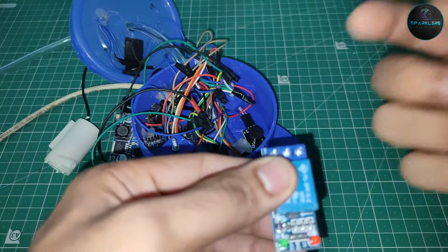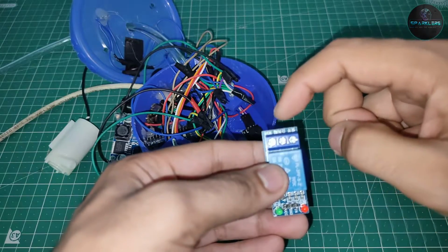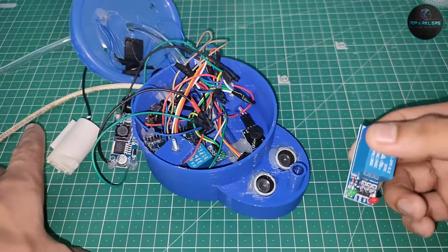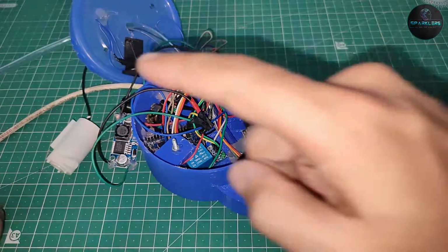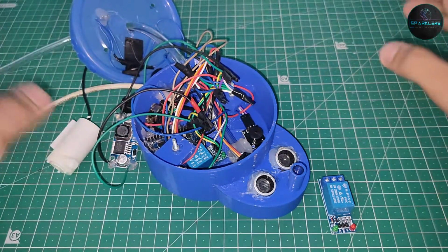rightmost pin. So whenever we turn this relay on, the relay will connect these two pins, the right one and the middle one, and our pump will get power and pump out the sanitizer. So this is how you will connect your Arduino to this relay and this relay to this pump.